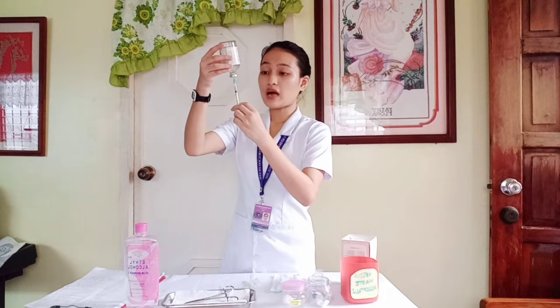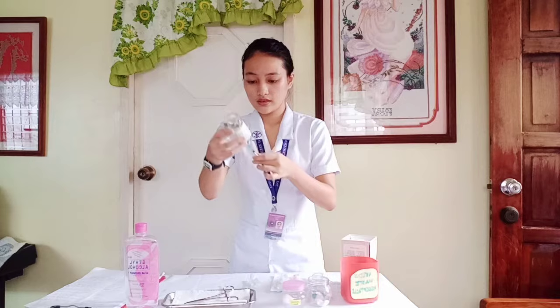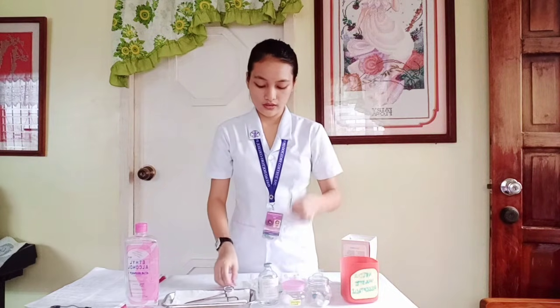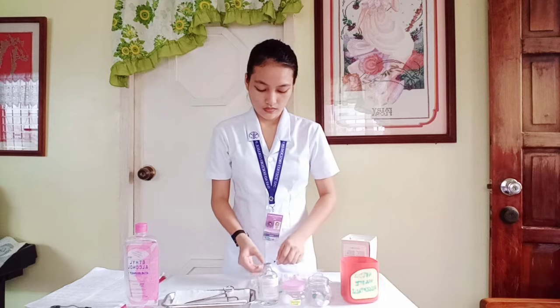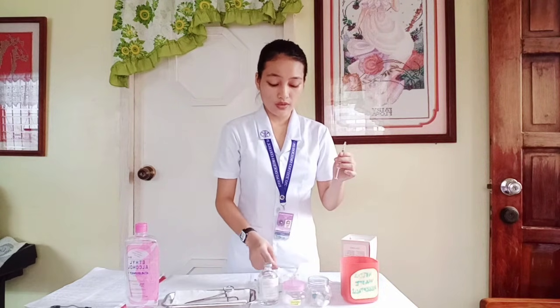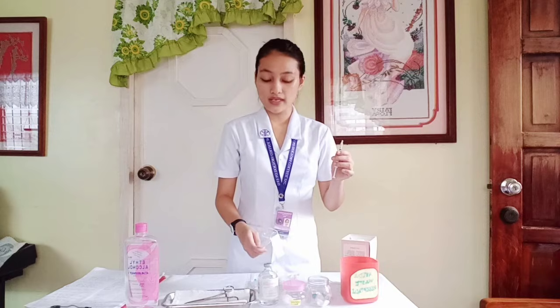Now, if there is an air bubble trapped inside the syringe, we can tap the barrel. And now we'll have to remove this aspirating needle and replace it with the right size needle that will be used for the actual administration of the medication.